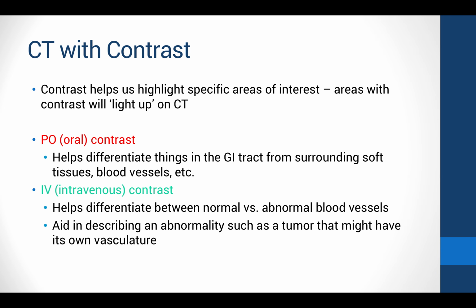It's not going to go into the GI tract. So it helps us visualize the way blood vessels are related to its surrounding structures.